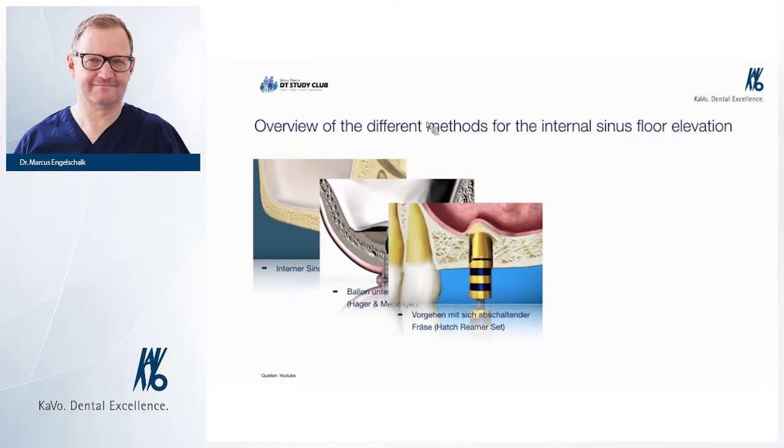So this means the first contact is very safe and very predictable for you, because this is very dangerous for the mistakes we can do. So it should be easy to perform. Significant elevation of the sinus membrane should be possible.